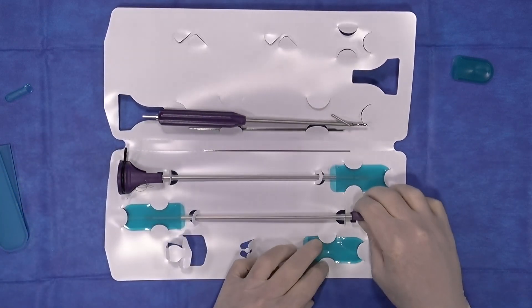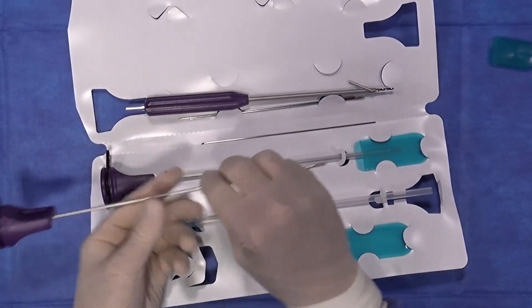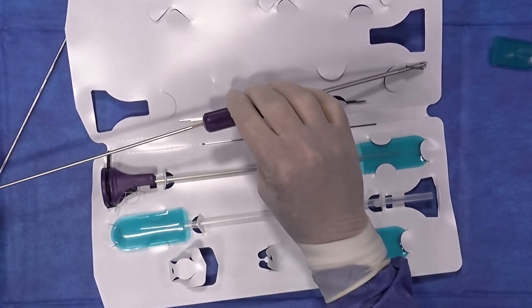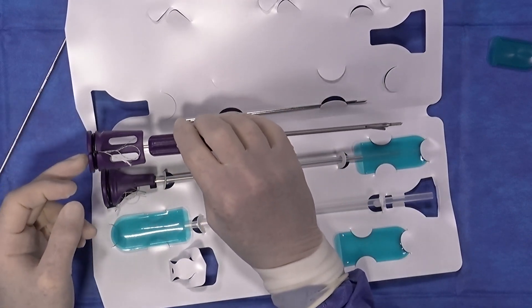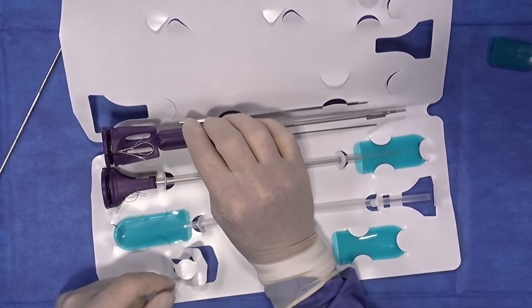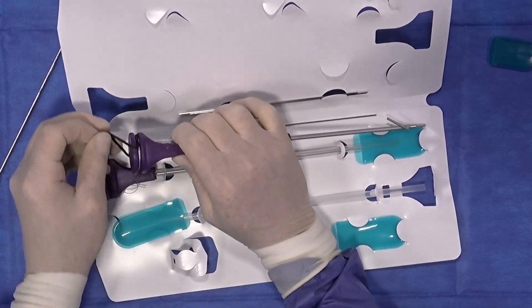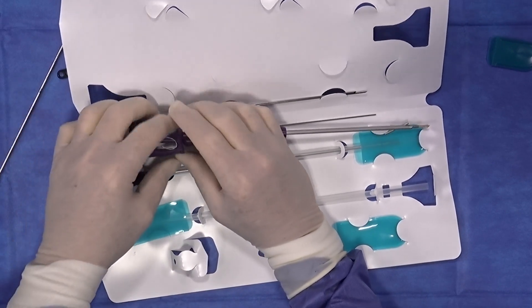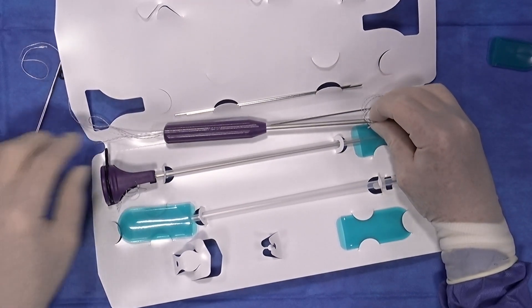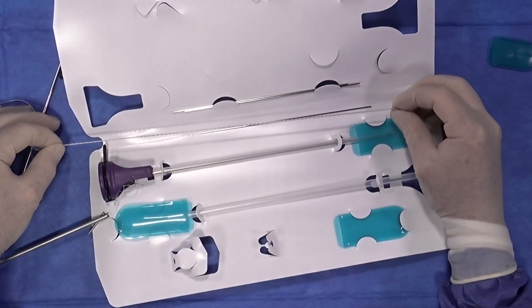The kit comes with two of the 3.0 knotless suture tacks. Once your hole is drilled, the guide is not moved — the guide is kept stationary. The tack fits through the guide and is impacted so that the handle of the knotless suture tack abuts the handle of the drill guide, giving you the appropriate depth. You then remove the rubber o-ring, which frees the sutures up and allows you to remove the inserter. You then remove the guide, and you have your repair suture along with your passing sutures.